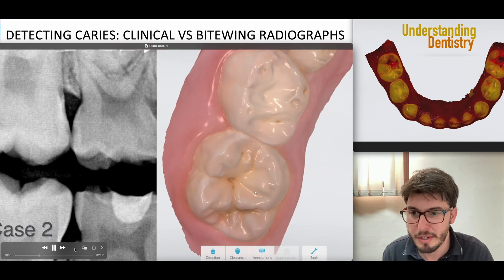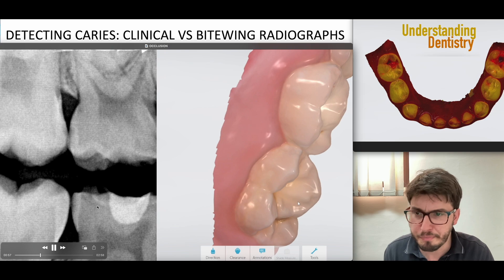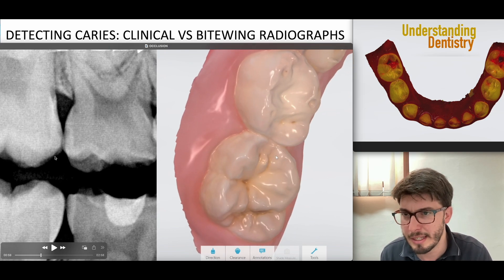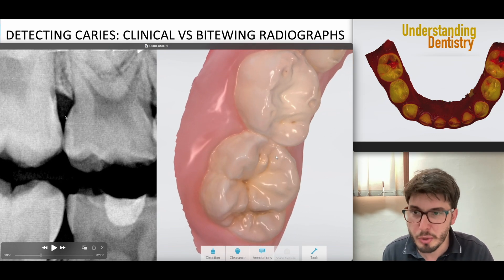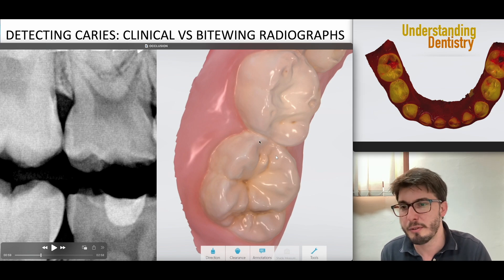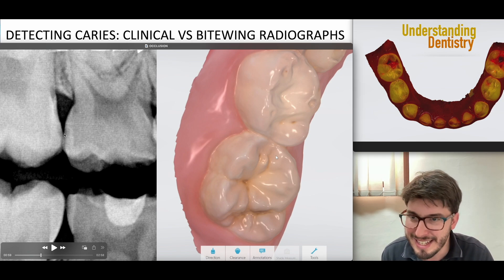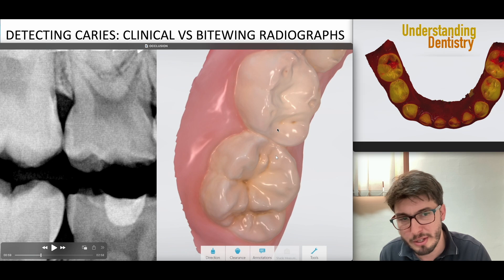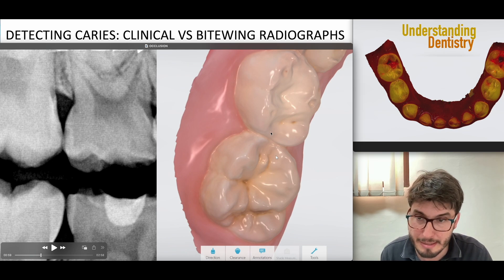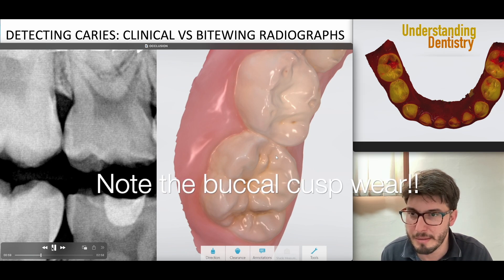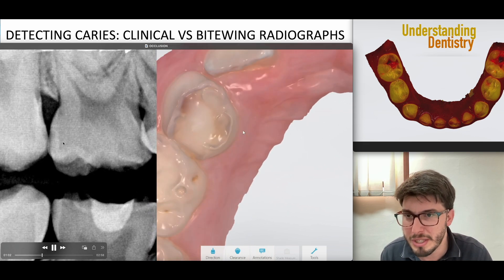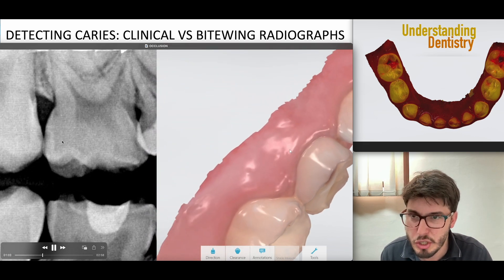Case two: we are seeing initial caries between those two molars — interproximal caries. You usually cannot see interproximal caries in the clinical examination. Since it's not in the dentine, this could be treated as initial.